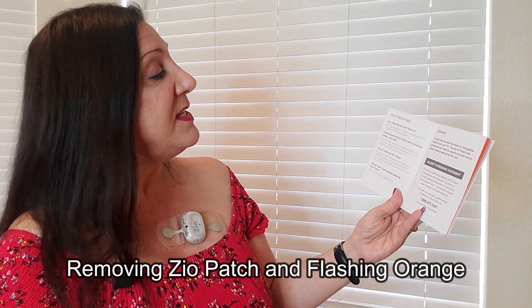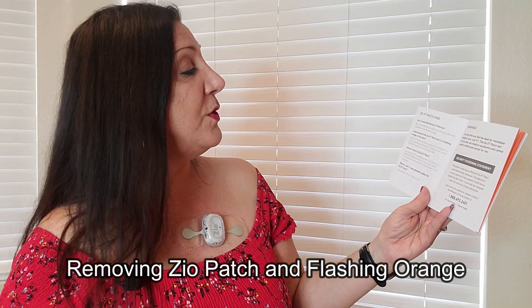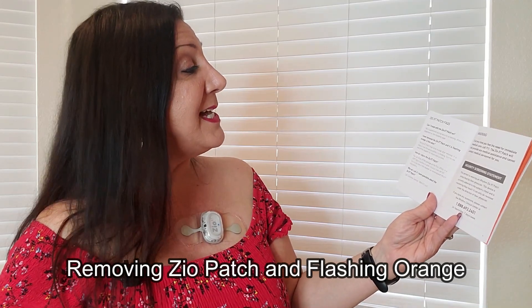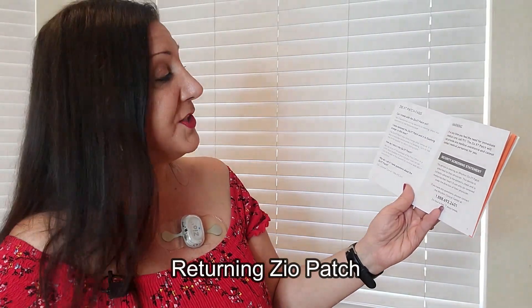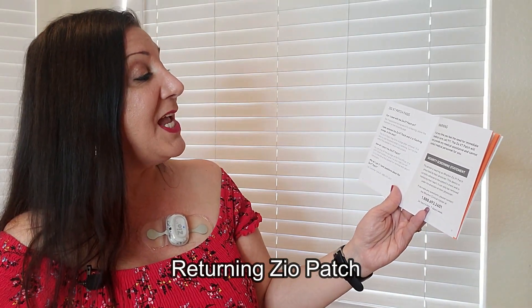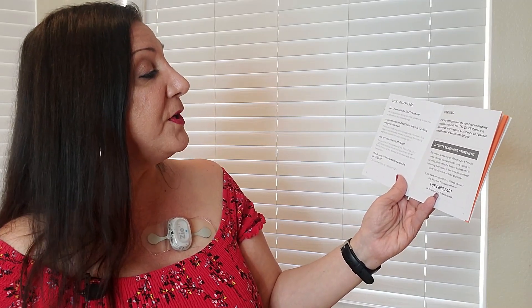If you have removed the Zio XT patch and it is flashing orange, that is okay — the patch may blink orange after removal and it is fine to mail the device even while it is blinking. How do you return the Zio XT patch? You can drop off the package at the post office, in the USPS blue mailbox, or give it to your mail carrier. Turn to the end of the booklet for removal and return instructions.